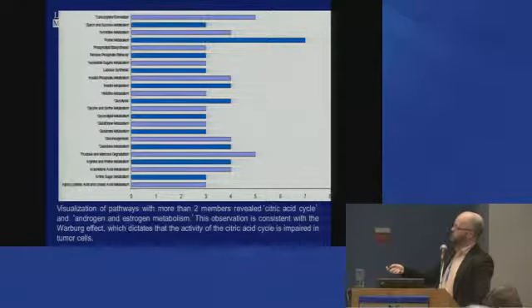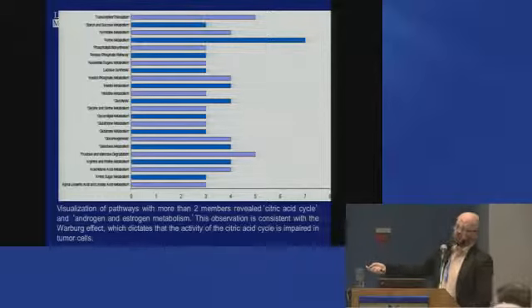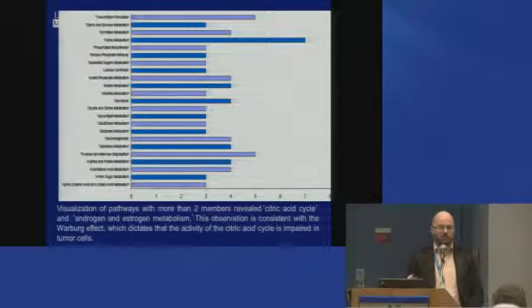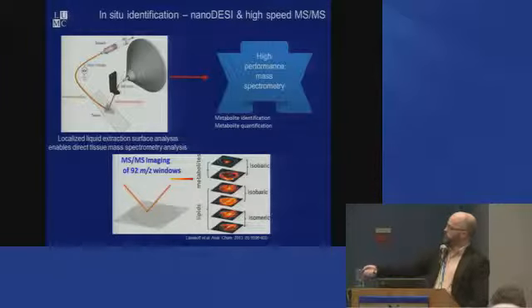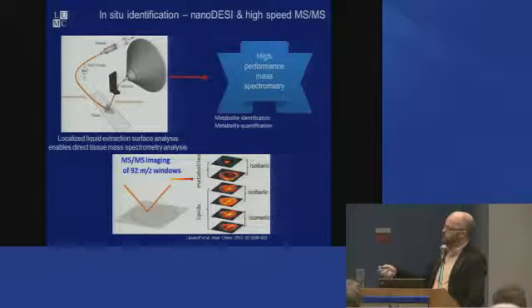What you can see is we can start looking at this pathway membership. This was also showing the citric acid cycle and androgen estrogen metabolism, and was fully consistent with the Warburg effect. Now, this is not quantitative, it's only the number of metabolites, but with mass spectrometry and suitable internal reference standards, we could get improvements in quantitation. Also, if we have a database of really present metabolites, we'll be able to reduce this number of mapped compounds.